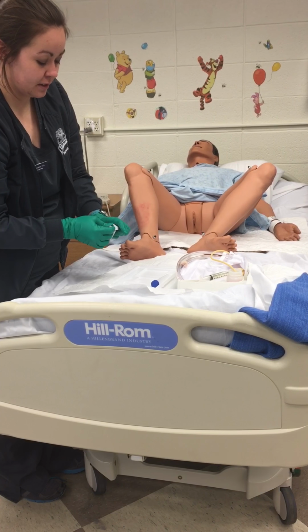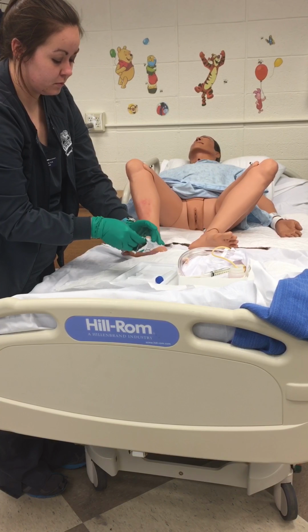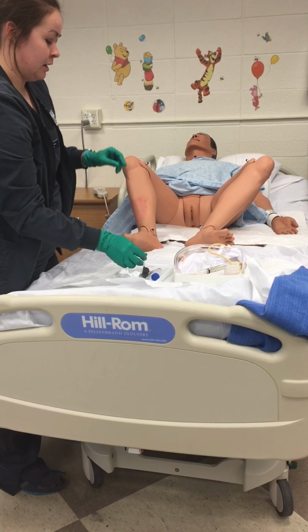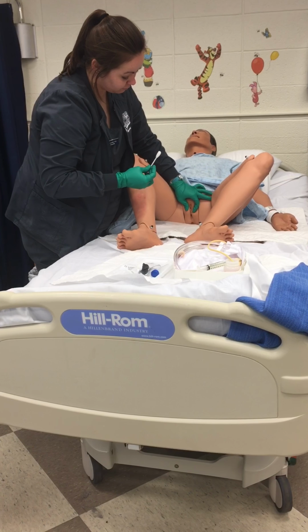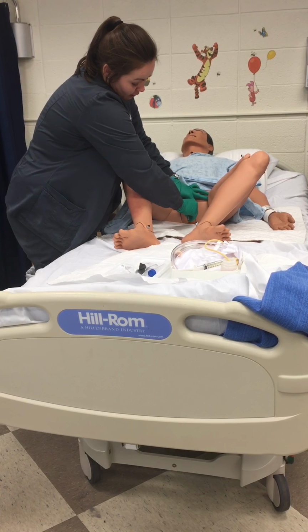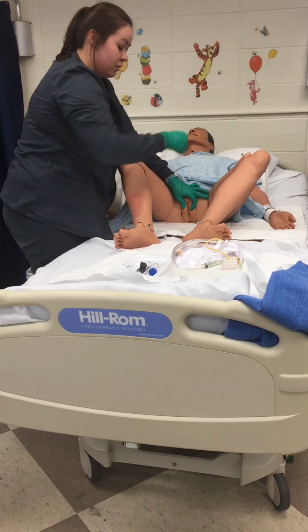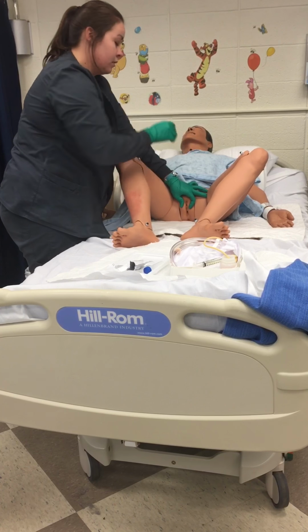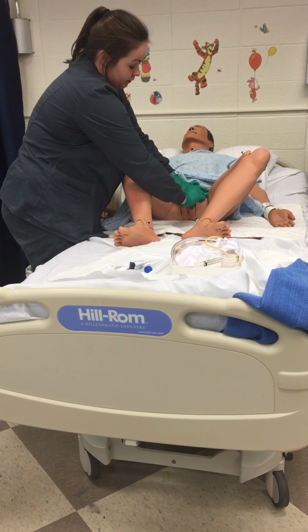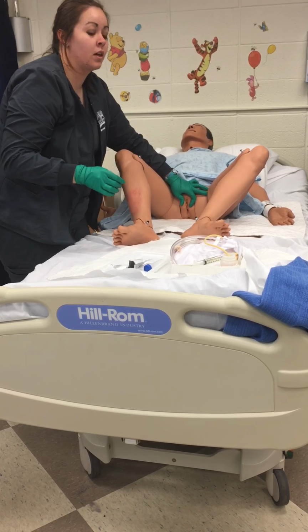After that, I would take out my sterile swabs, and with my non-dominant hand, I would spread the labia and begin from front to back, on the side from front to back, and again from front to back.